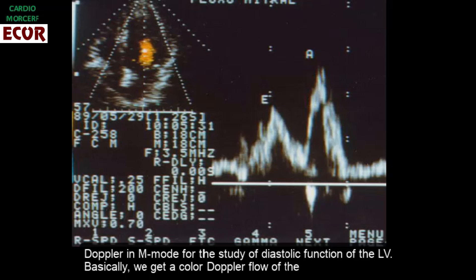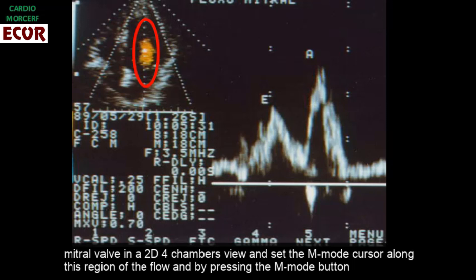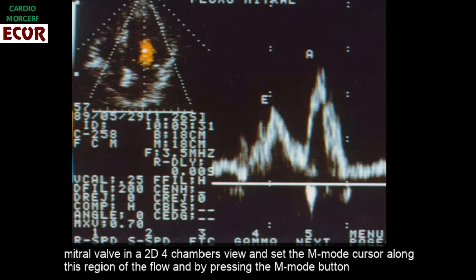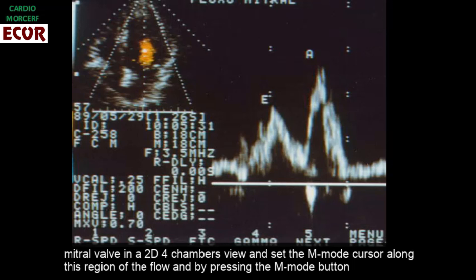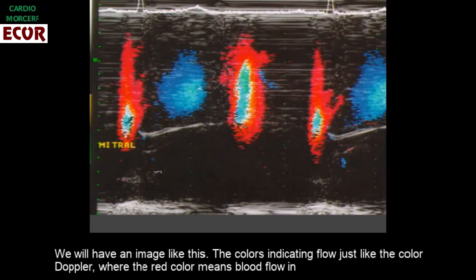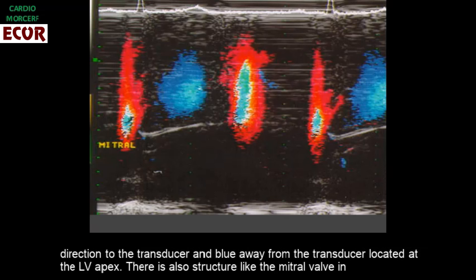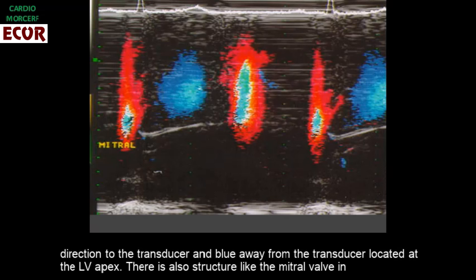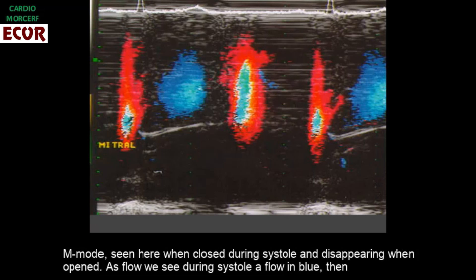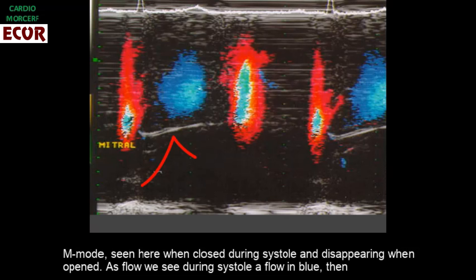Basically, we get a Color Doppler flow of the mitral valve in a 2D four-chamber view and set the M-mode cursor along the region of the flow by pressing the M-mode button. We will have an image like this, the color indicating flow just like the Color Doppler, where red means blood flow toward the transducer and blue away from the transducer located at the left ventricular apex. There is also a structure like the mitral valve in M-mode, seen here when closed during systole and disappearing when opened.